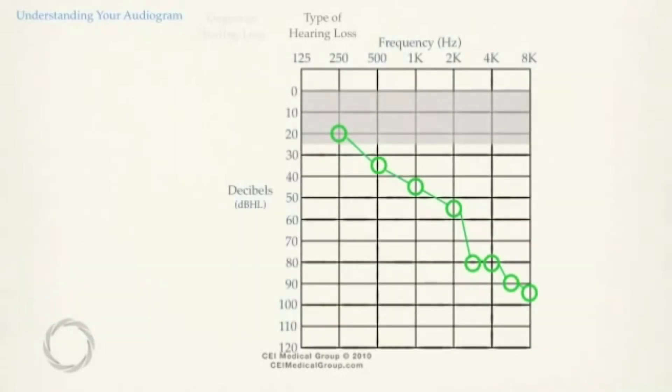Let's go back to our example. Your audiologist will mark a red triangle at the softest sound that you respond at for each frequency, much like how the previous responses were obtained. If bone conduction responses are obtained within normal limits, a conductive hearing loss is documented.